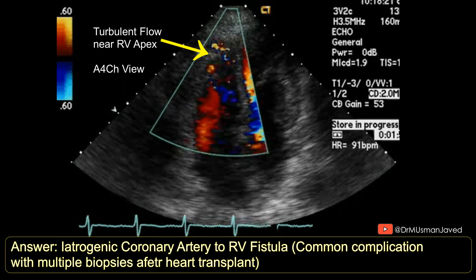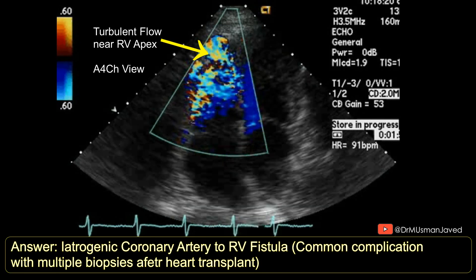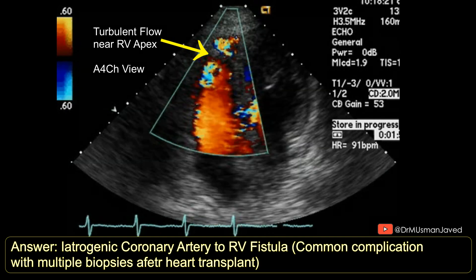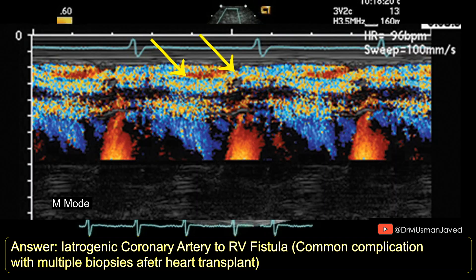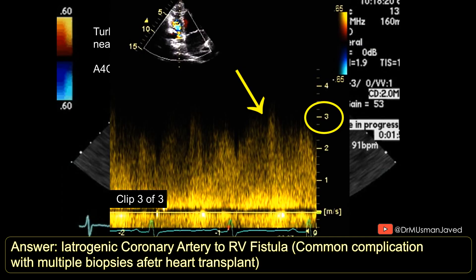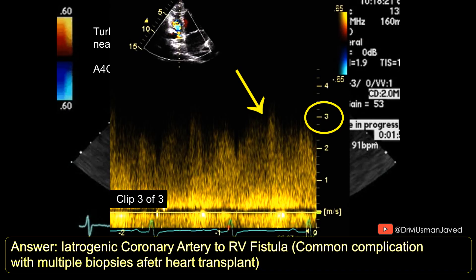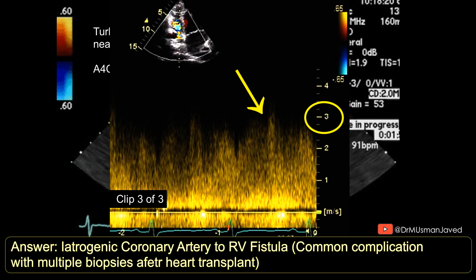In the apical four chamber view, there is a turbulent flow near the apex. M-mode and continuous wave Doppler confirmed high velocity flow throughout the cardiac cycle.